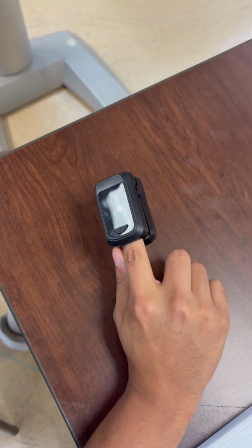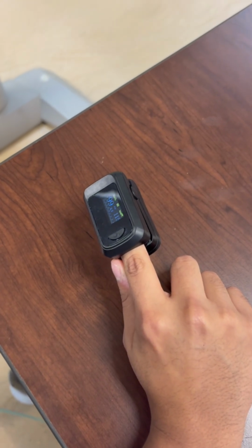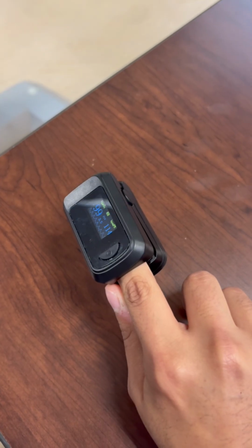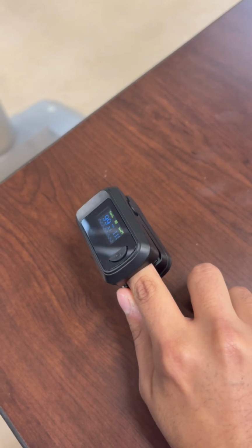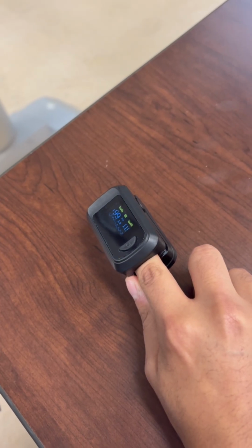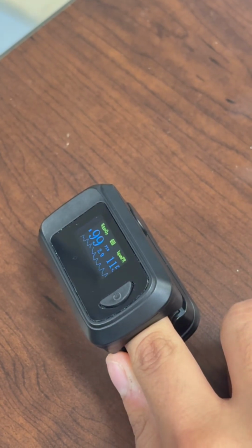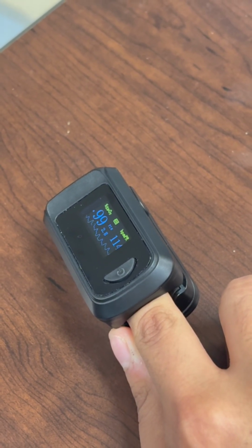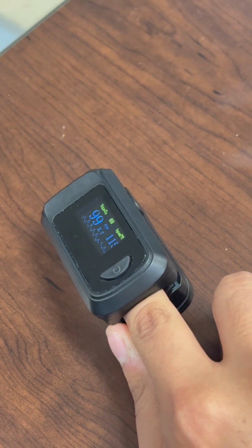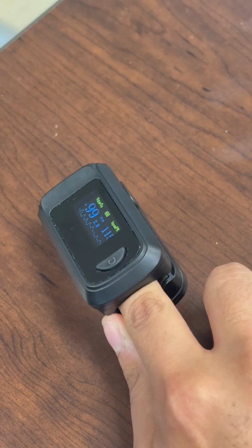So now that we've got the reading, on the right side, that'll show the beats per minute for the patient, but we're going to be looking more at the left side. Right above is going to be the percentage SpO2. That is the number we're going to be looking for. So right now we got a reading of 99%, and that is within normal range. Anything between 95 and above is the numbers you're looking for. Those are perfect numbers. Anything below 95 will be some significant clinical considerations and may need some additional testing to determine what is causing the lower numbers.